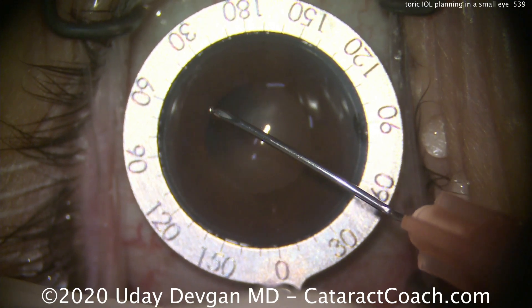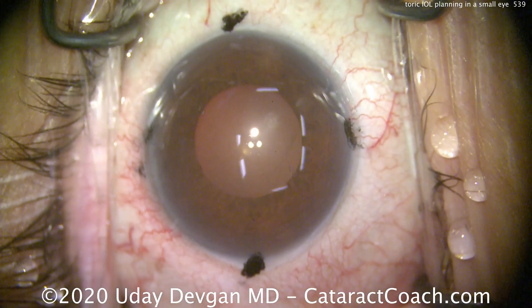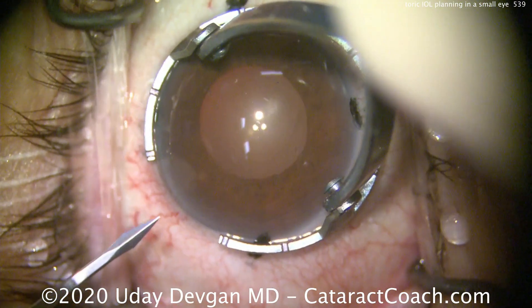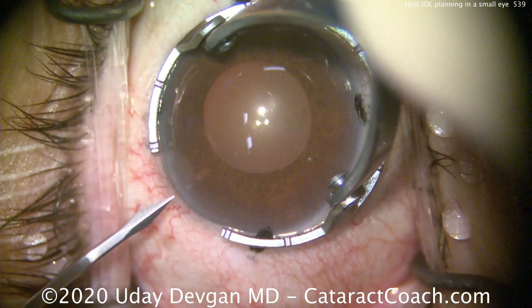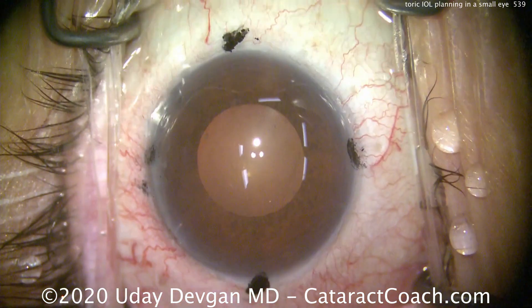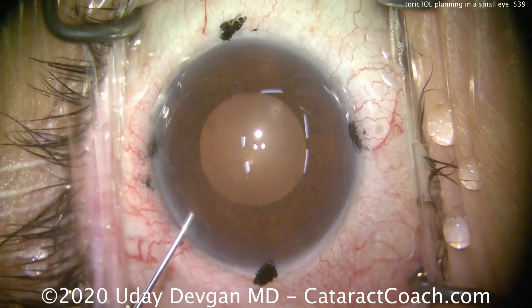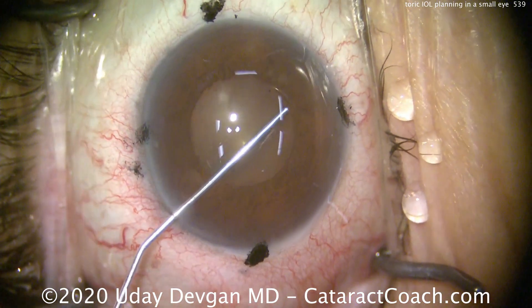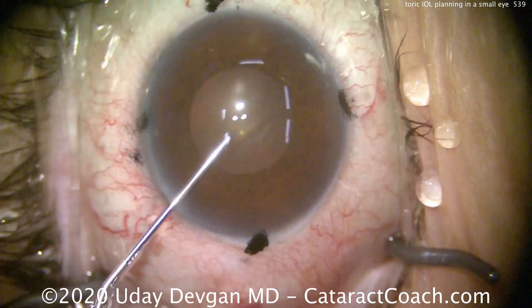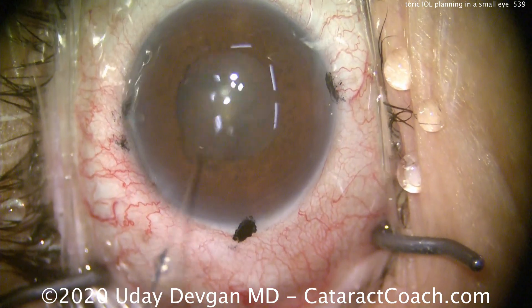Because that's where we're going to place this lens. We certainly have in our Beverly Hills surgery center the fanciest equipment — we're able to use intraoperative aberrometry and special overlays that show you the corneal astigmatism in the surgeon oculars. But for the benefit of the rest of the world which may not have access to this very expensive equipment, let's show you a traditional way as well.